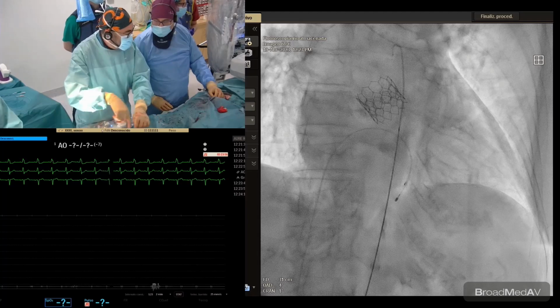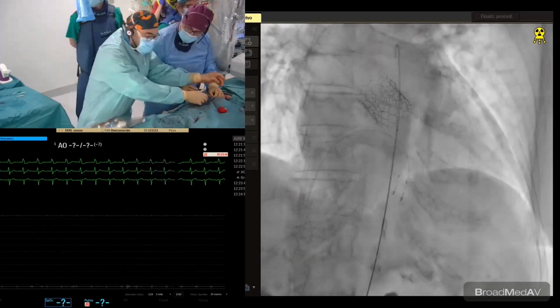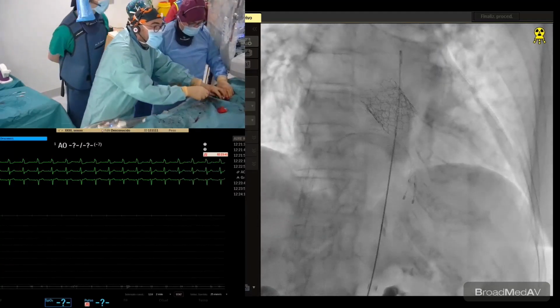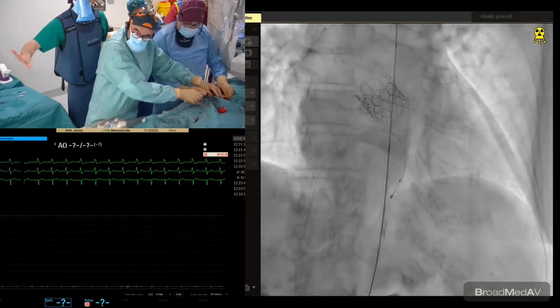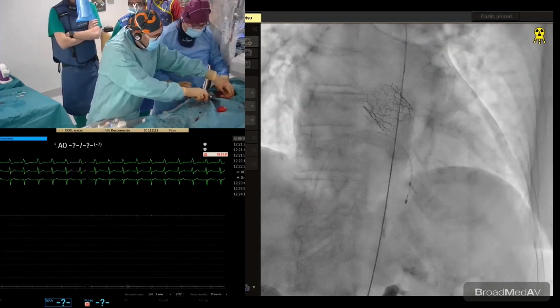So what we are going to do now is to retrieve the sheath. The MANTA device is prepared, I think. ¿Necesitamos el director o no? No, este no caso. Me falta. Espera, chus. Sí, wait a moment. No, pues que lo he preparado.